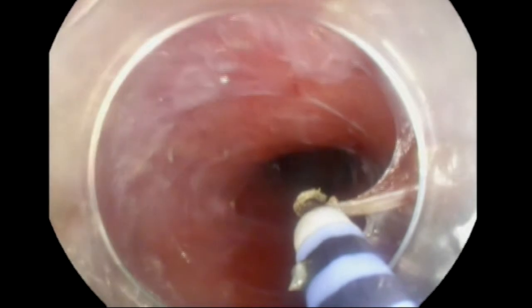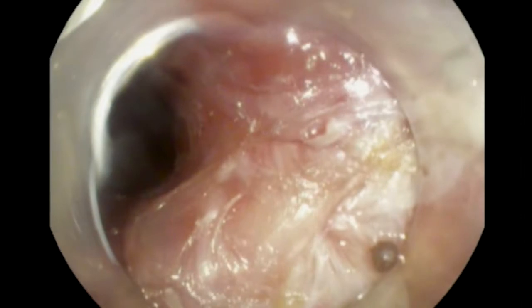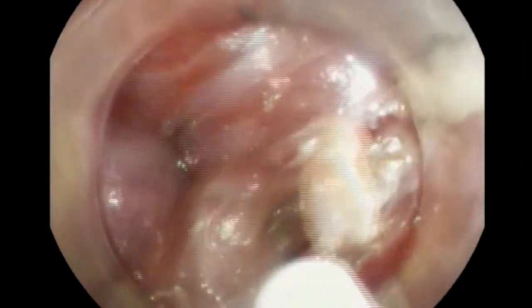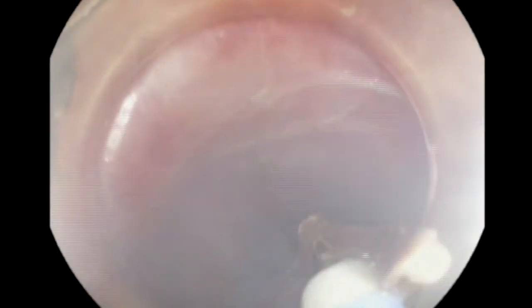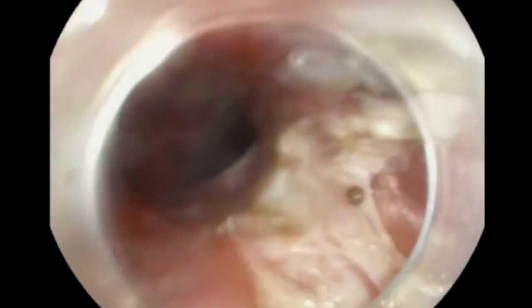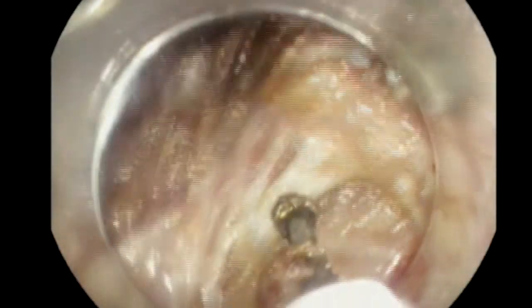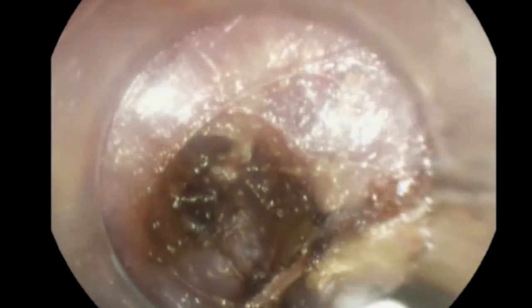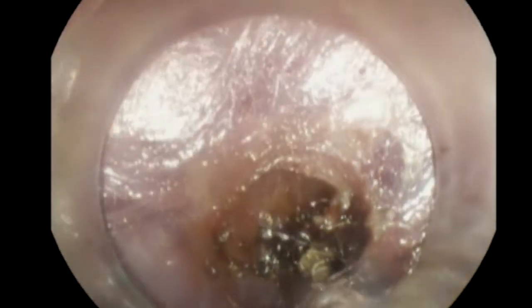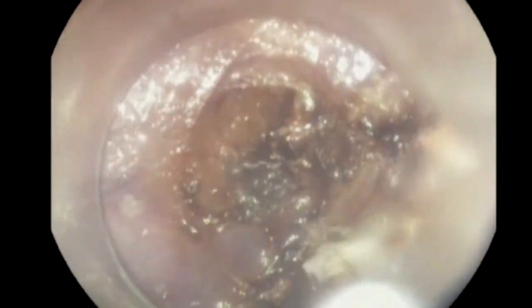And we will continue dissecting through that. When we are doing this, we can either place the muscle at 12 o'clock and dissect, or we can place it at 6 o'clock and dissect as we see here. If you dissect at 6 o'clock, you have to be careful not to extend your needle into the mucosa and create a hole — that would be a direct perforation. So you would like to prevent this from happening. Putting the muscle at 6 o'clock requires much better control of your endoscope. It is always fine to put your muscle at 12 o'clock to be more safe.